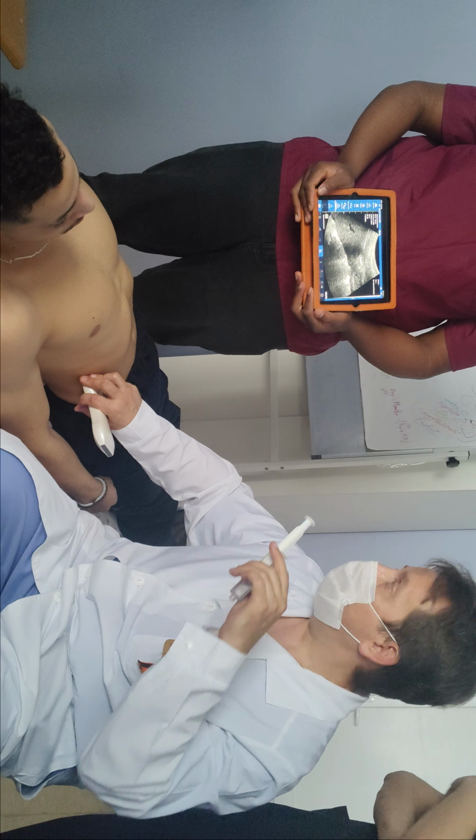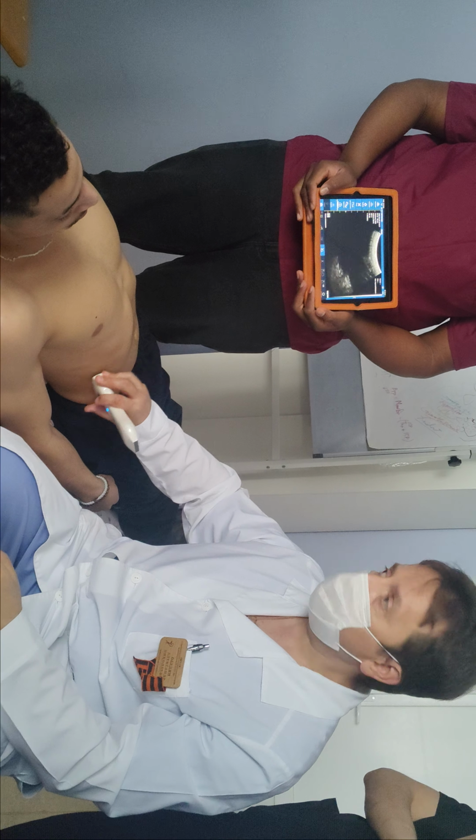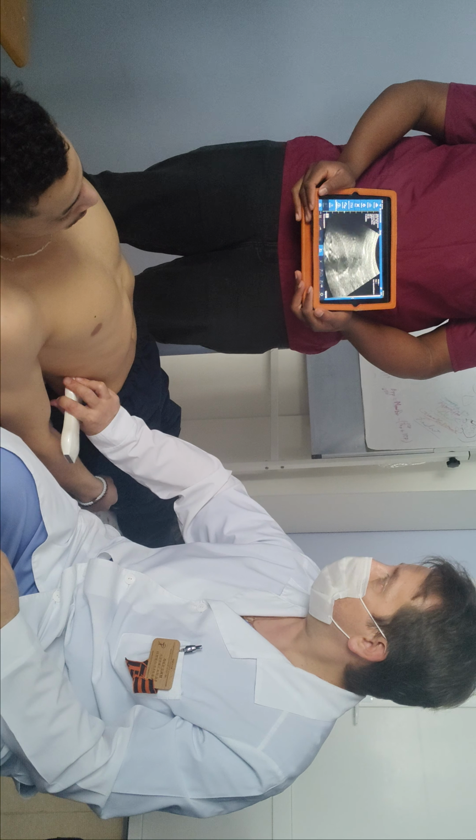Again, colleagues, you should find that picture. Slide in and find the best positioning. It may take some time. Here it is, another zone.